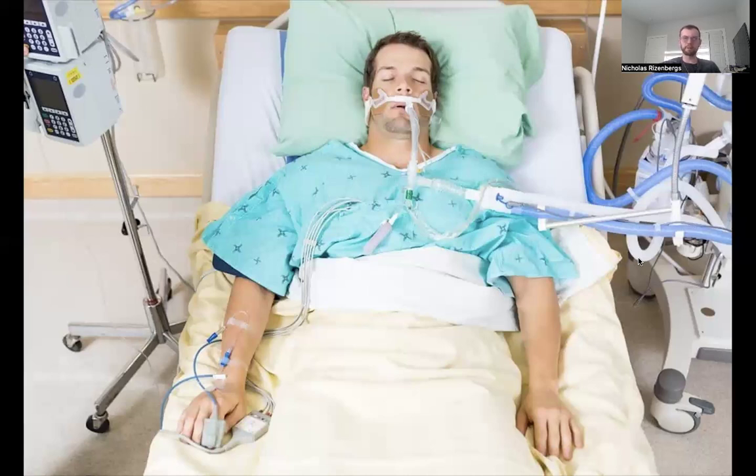I also want to check his minute ventilation, make sure it's less than 10 liters a minute. His respiratory rate's less than 30. His tidal volume is over 5 mLs per kilogram of ideal body weight. Vital capacity, which will be part of the pulmonary mechanics, is greater than 10 mLs per kilogram of his ideal body weight, or greater than a liter. His MIP, or negative inspiratory pressure, is greater than -20. His RSBI, or rapid shallow breathing index, is over 100. Or excuse me, less than 100. His SpO2 is greater than 92%, and he is not showing any more of those signs and symptoms, or at least has progressed in a positive way.